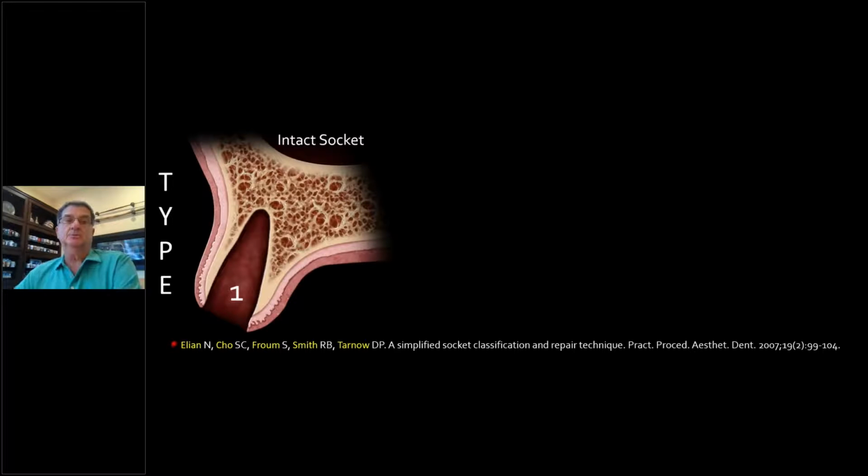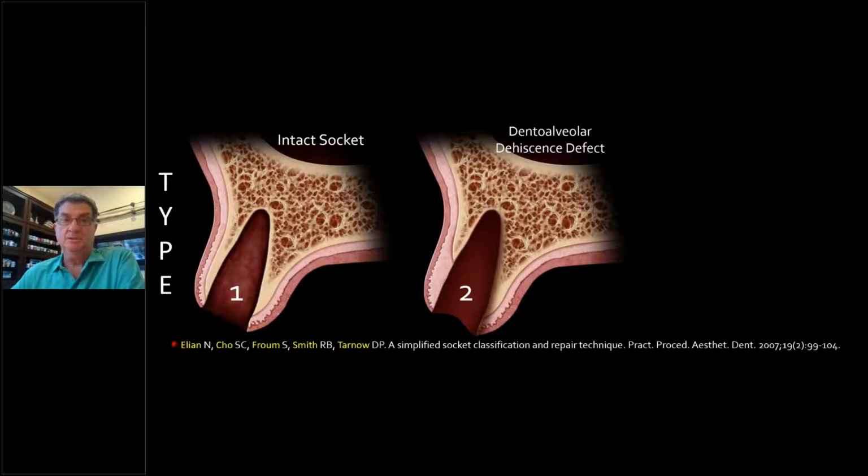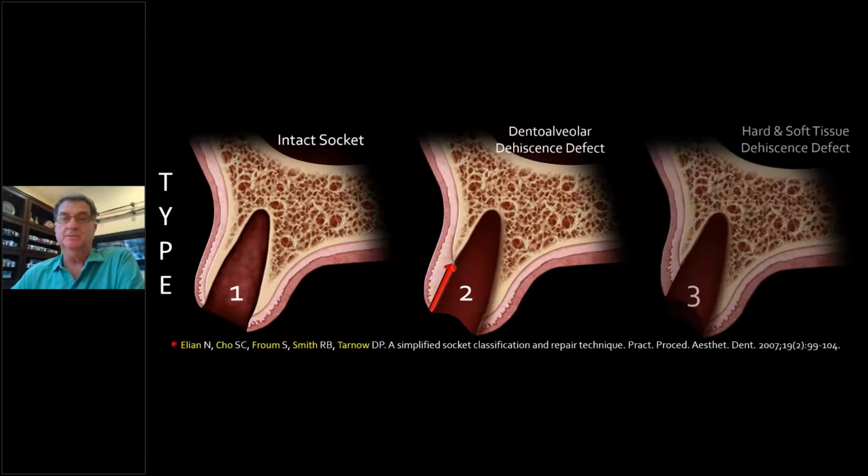Now, basically, there are three types of sockets. I came up with this in the year 2000. I presented this concept at the American Academy of Periodontology, and we finally published it in 2007. There are really three socket types, based on the buccal plate. Other people have different versions of this, but everybody has a type 1 socket, no matter which classification you look at. A type 1 socket is where, after you take the tooth out, you have a buccal plate and beautiful tissue over it. We'll talk about the thickness of the bone in a second.